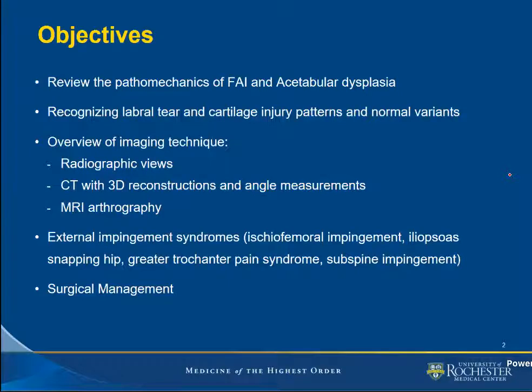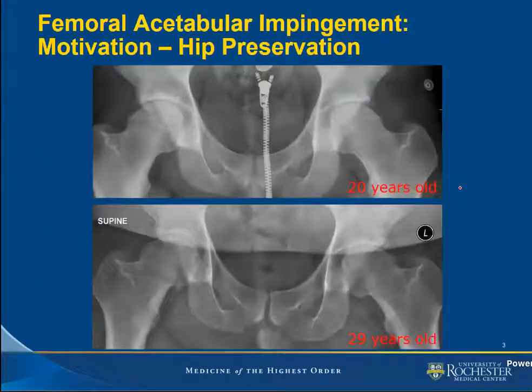Then we'll turn our attention to external impingement syndromes, which might confuse the surgeon into thinking that the patient has femoral acetabular impingement. And throughout the talk, we'll focus on concepts of how the surgeon is thinking in terms of surgical management. So what is the motivation behind studying femoral acetabular impingement?